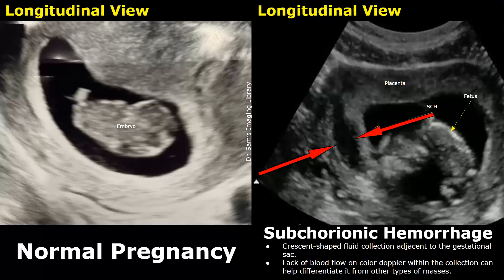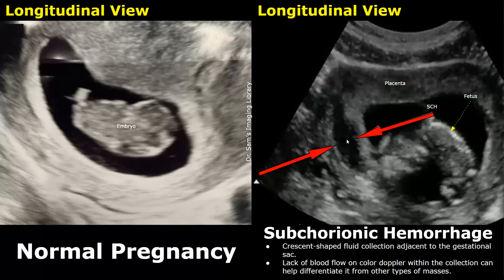The shape of the hemorrhage is usually crescentic. Although color Doppler is not recommended in early pregnancy, it can be used sparingly in some situations such as a subchorionic hemorrhage. A very short application of Doppler can be used to check for vascularity. The hemorrhage will not show any blood flow, and no Doppler signals will be found inside the fluid collection. This feature differentiates it from other masses.